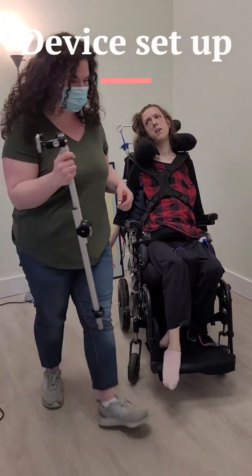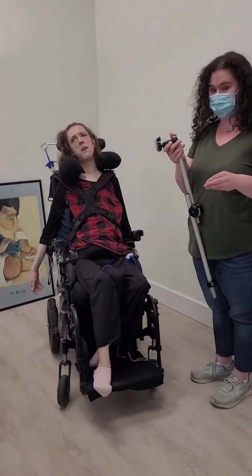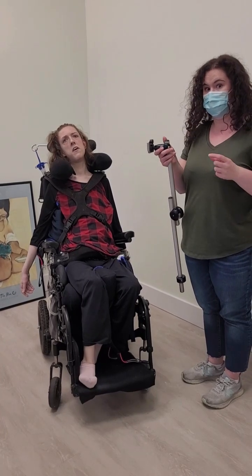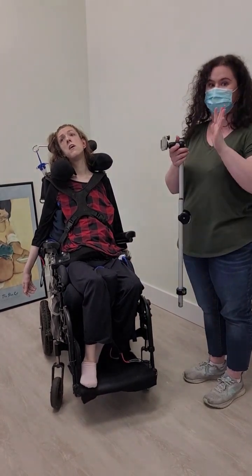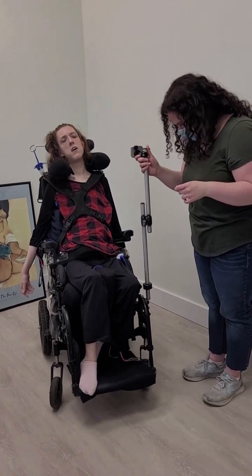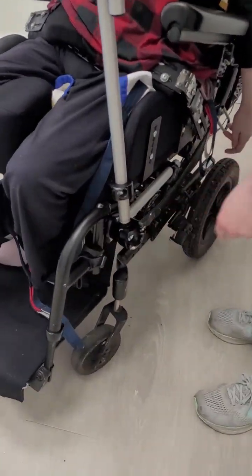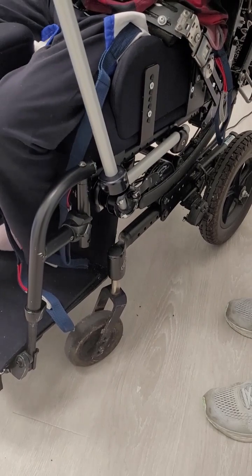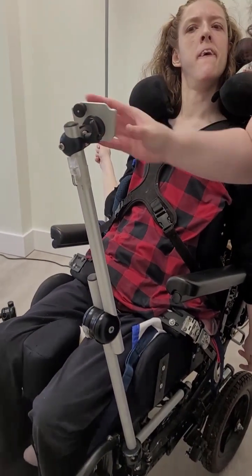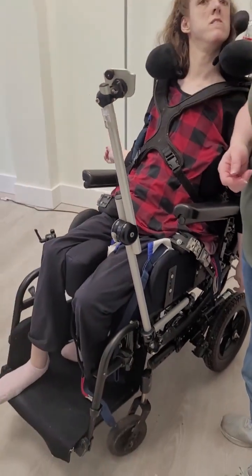First we start with the pole, which is found in the far back of Julie's closet. There are two poles — one is her travel pole and the other is the device pole. They look very different. In this section right here, you just kind of have to line up the pole and it slides right in. Turning it will make sure that it's facing directly towards Julie, and then you know you're good to go.